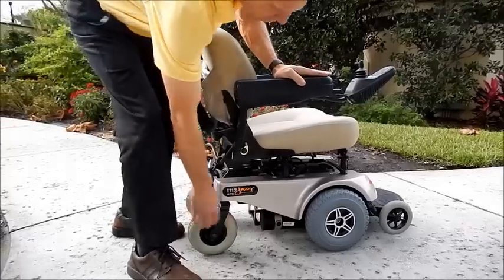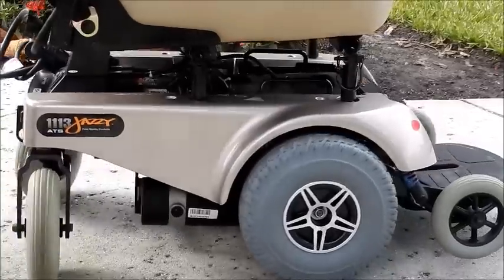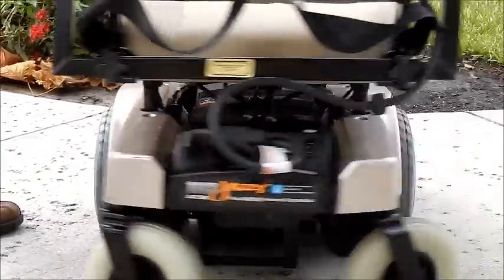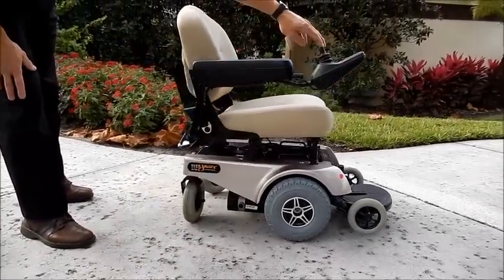This chair has solid tires all the way around. This is one of the most maneuverable chairs available on the market. It has one of the best turning radius. It turns on itself and it's very easy to drive inside the house.